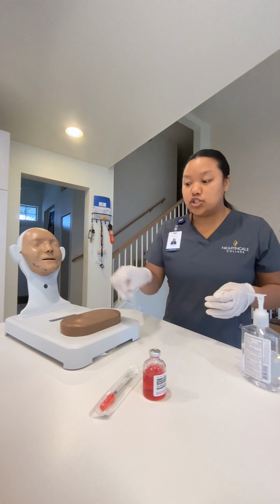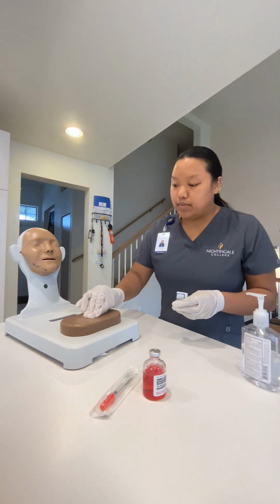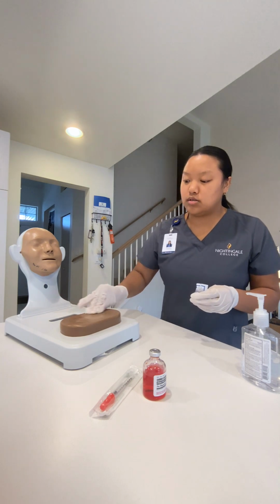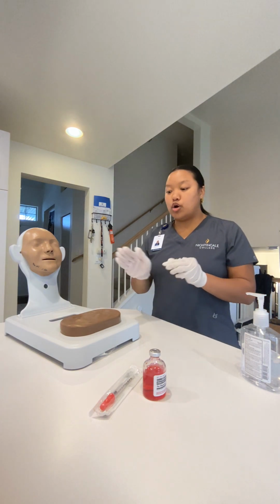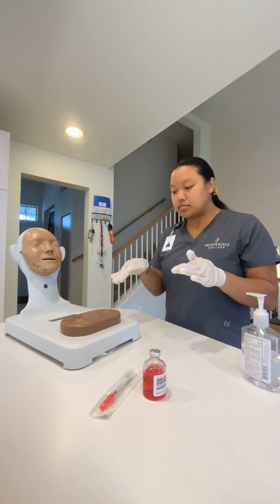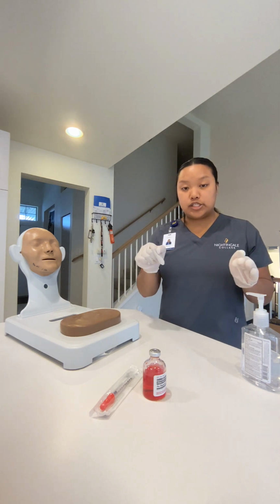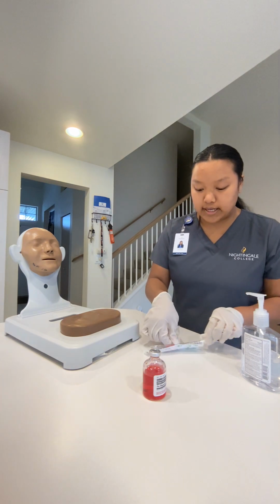So I'm gonna go ahead and just clean her skin while we're at it. So you're gonna start from the middle and then out 2 inches. Then you wanna toss this in the trash, and then you don't wanna touch the skin again while it's drying at all, unless you're ready to inject, okay? So now I'm gonna get our solution ready, medication.